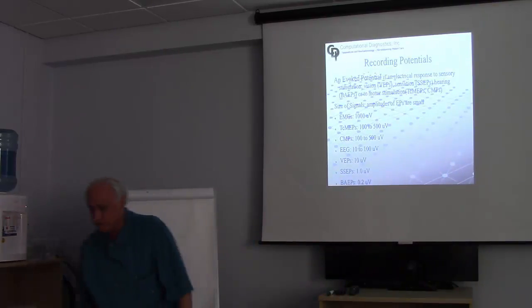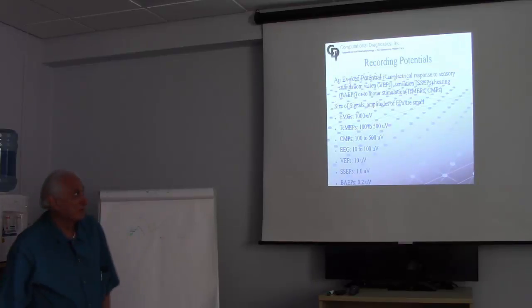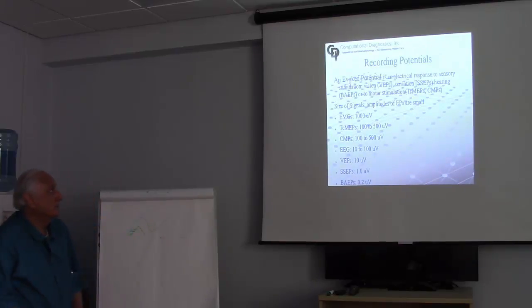So an evoked potential, which is one of the major tools we use, is the electrical response to sensory stimulation, either visual, VEPs, sensation, SEPs, hearing, or to motor stimulation with transcranial motor potentials or compound muscle potentials.